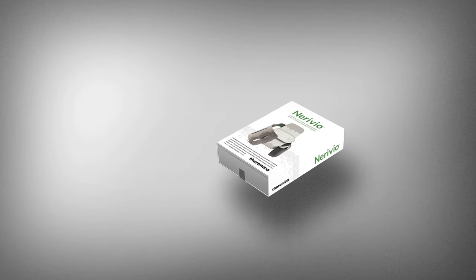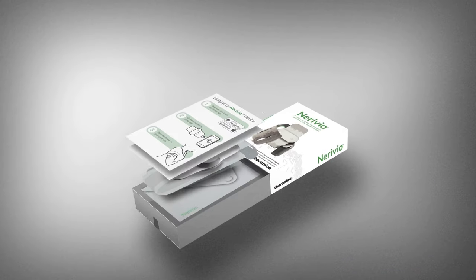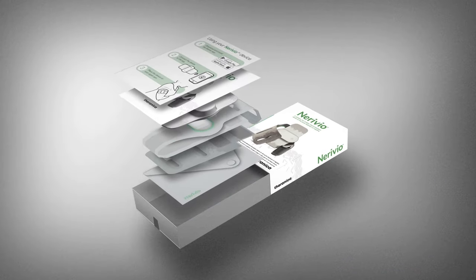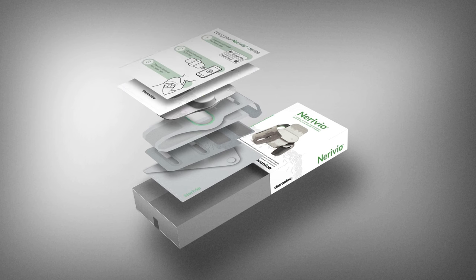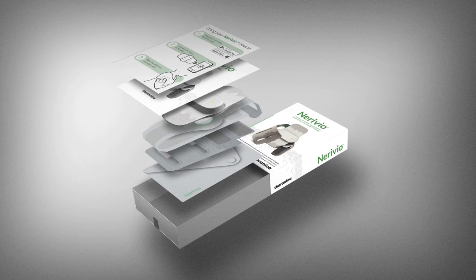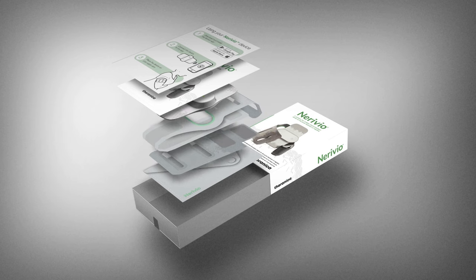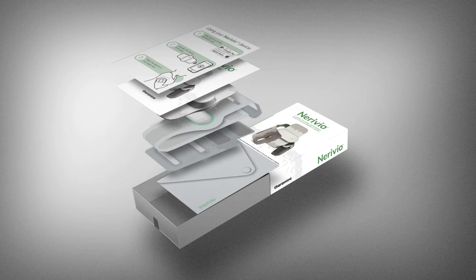This is the Nerivio package. It contains the device, an instruction leaflet, a quick start guide, an arm band to improve the stickiness of the device to your skin, an extension for the arm band for larger arm sizes, and a travel bag.